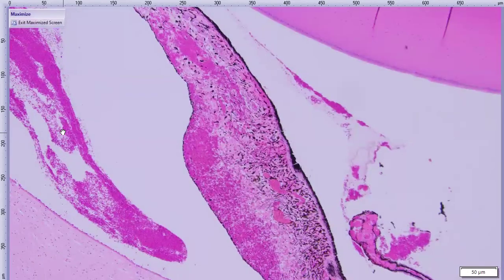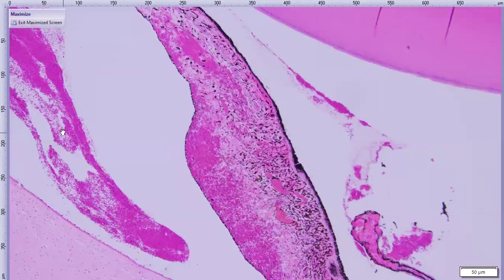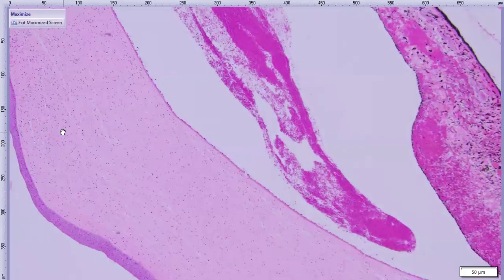So, I was able to confirm some of their clinical findings, not all of them. I couldn't really comfortably say that this was keratomalacia. But there's certainly really severe corneal stromal edema. There is a break in Descemet's membrane, which could be due to trauma, like penetrating trauma. I don't personally think a spider bite would do that. I could be wrong. One possibility is a spider bite of some sort that would have led to severe corneal stromal edema and then a break in Descemet's, but I find that hard to believe too.